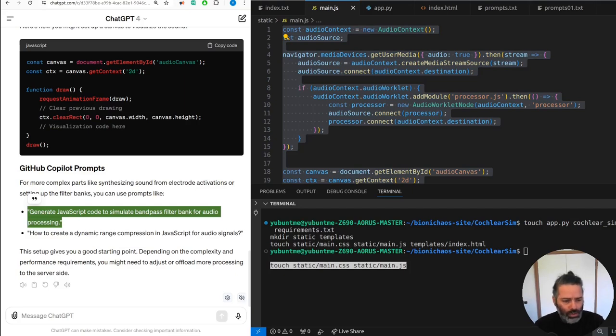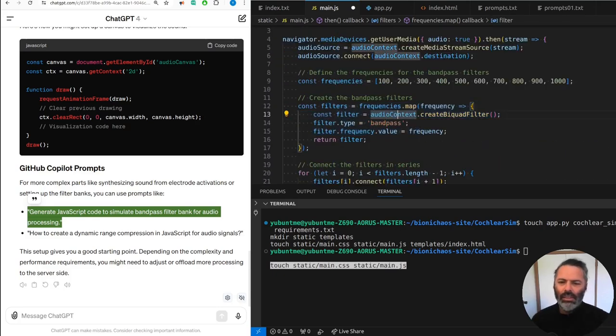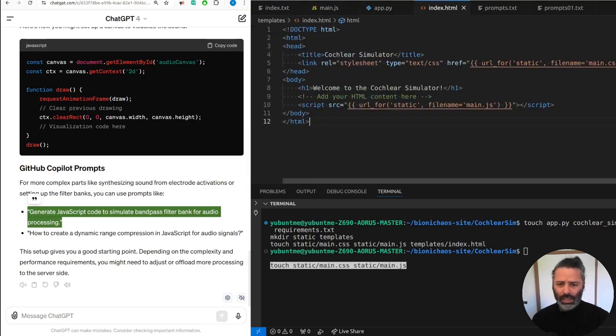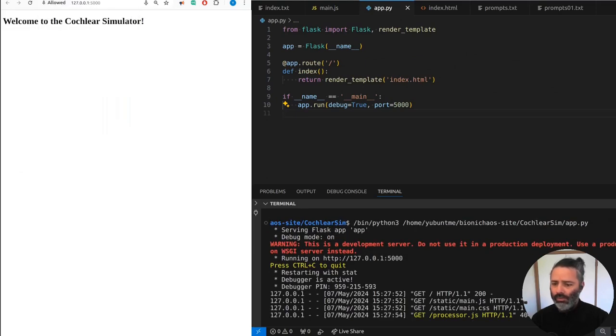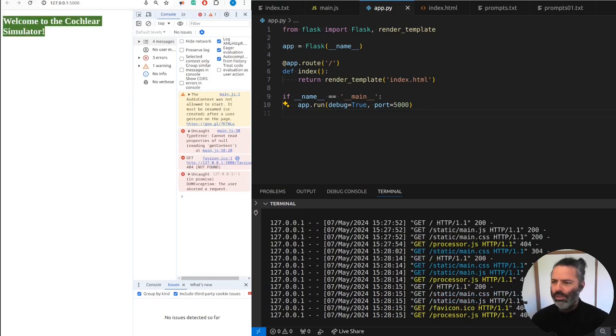So that's in JavaScript. Generate JavaScript code to simulate a bandpass filter bank for audio processing. And we have some frequencies, bandpass is fine. Wait, they're all bandpass? Yeah, we'll get to it in a sec. Something actually displayed on the HTML. Okay, we need to allow the microphone. And nothing is displayed. Must be an error: after user gesture. Okay, doing a gesture on the page.